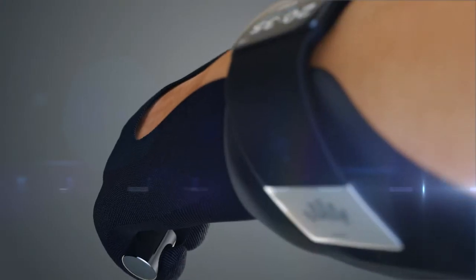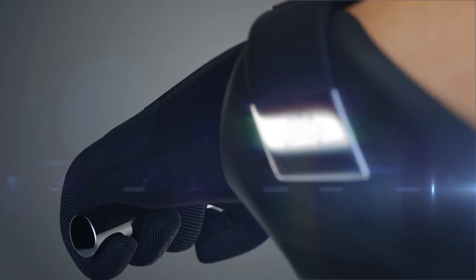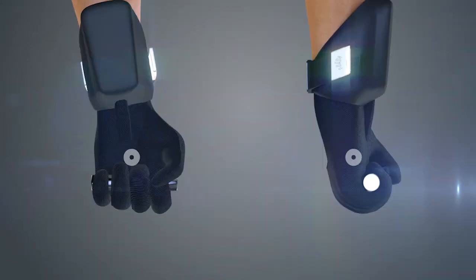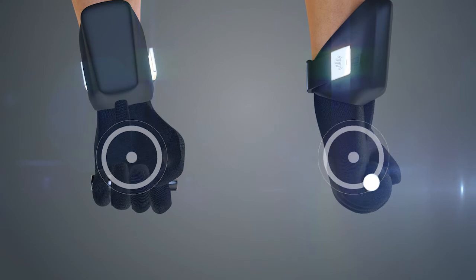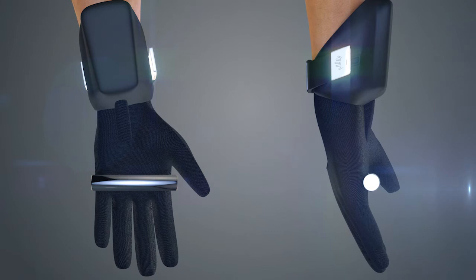The user can completely relax their hand and still maintain hold. In this situation, if nothing happened, the user would not be able to open the hand, even if he tried. However, when the user wants to open the hand, the glove's integrated sensors recognize the user's intent and allow the hand to open.